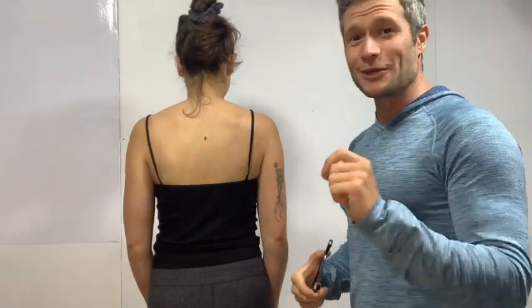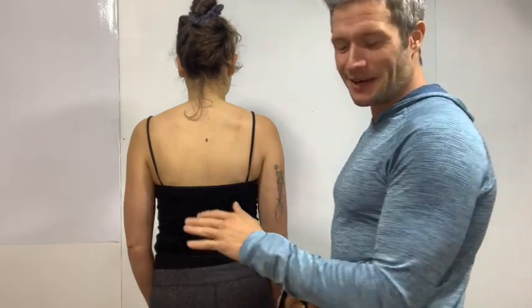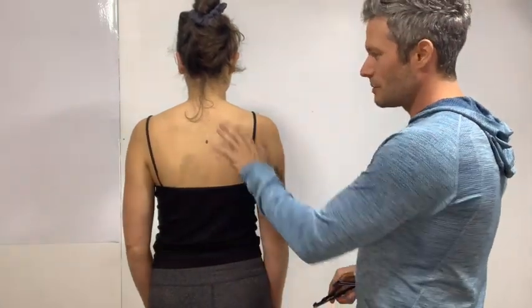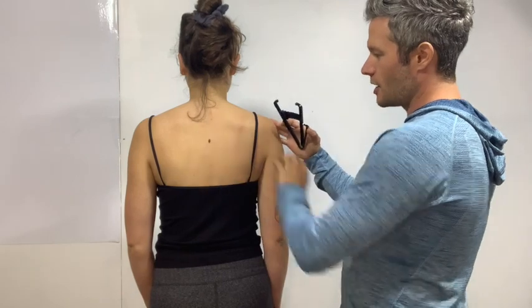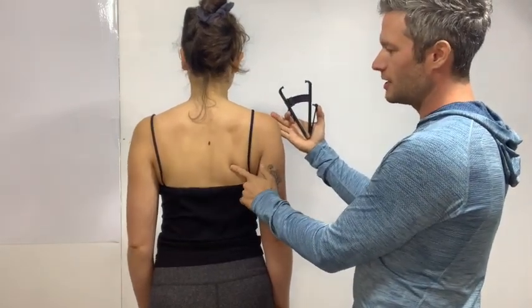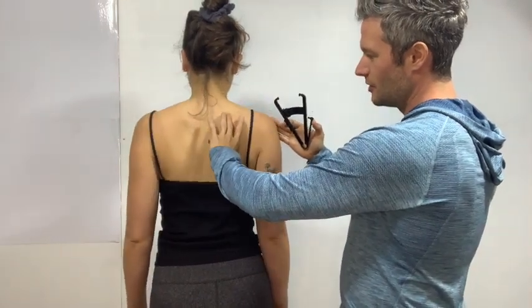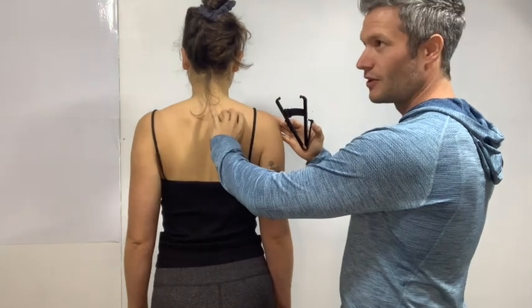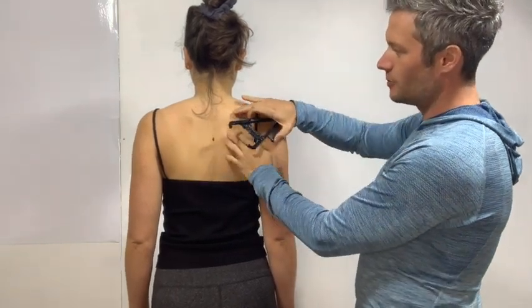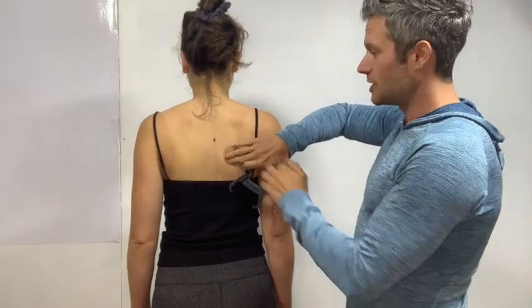Now I've done this quite often, so you'll notice I haven't made a little marker with a water soluble, not a permanent marker on my client or volunteer here. But I'm going to landmark the shoulder blade. So if I'm having troubles with that, I'll just ask you to squeeze back your shoulders a bit. Good. Kind of shrug up a little. Good, and then back down. Good. Okay. So again, you can find the person's shoulder blade by working across, feeling down the border as well. It'll be the little part that sticks out there.